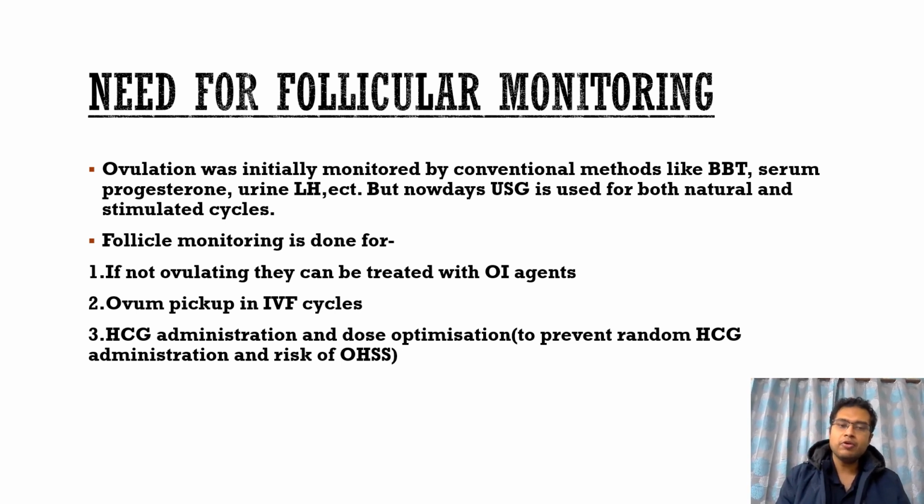Follicle monitoring is done for three main purposes: to determine if the ovary is actually having any follicles which are ovulating or not. If they are not having follicles which are ovulating, they'll be treated with ovulation induction agents like clomiphene citrate.